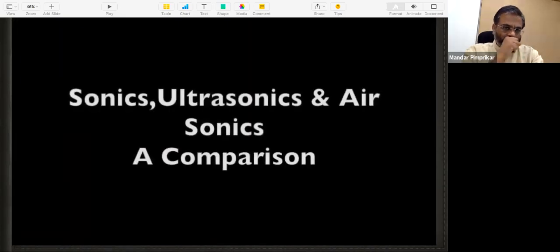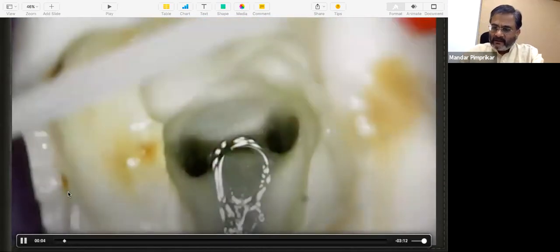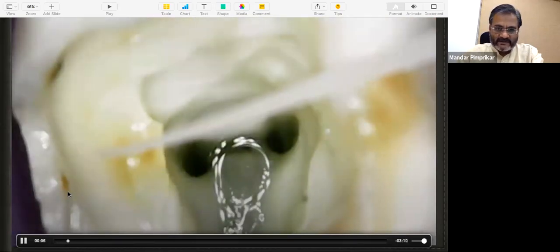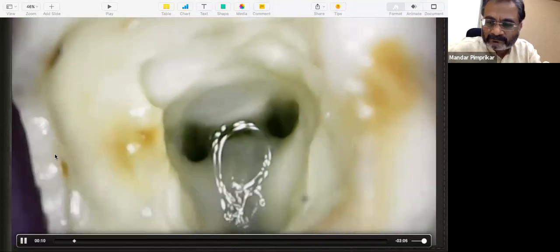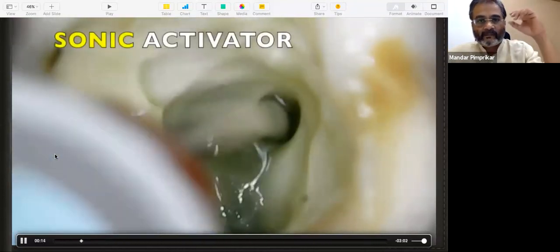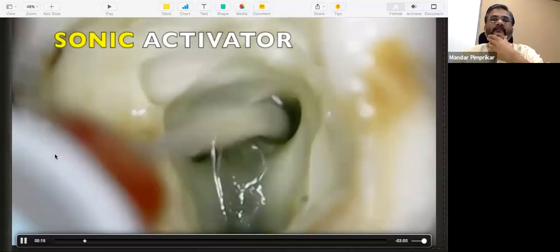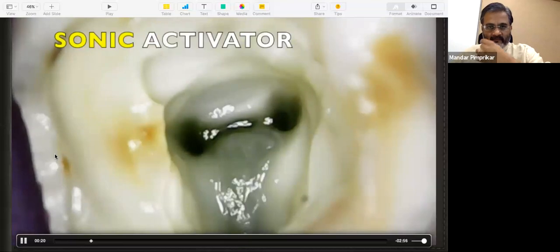Now here is one video which has a commentary, so you can just listen to it. Here I've tried a comparison: activation or agitation of the irrigants can be done with sonics, ultrasonics, and air sonics, apart from manual dynamic agitation.